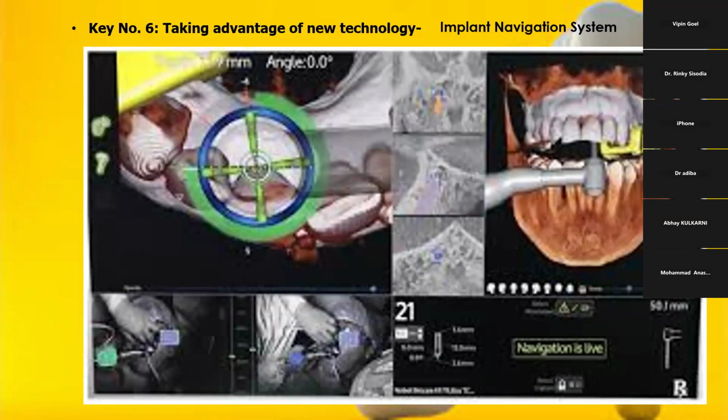As we are going inside, there will be a green sign on the screen also. If we are going to approach near any nerve or we are changing any part, then there will be an arrow mark or it will turn red, showing that we are affecting any vital organs. And when red appears, we just have to stop there. So it's a type of tactile sensation which is converted into visualization.